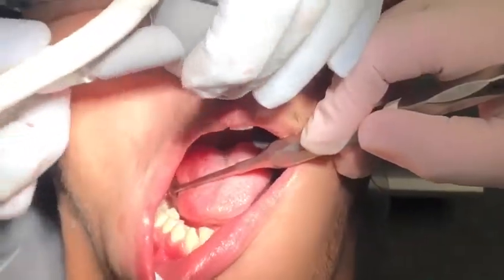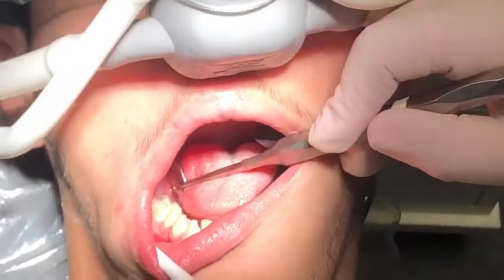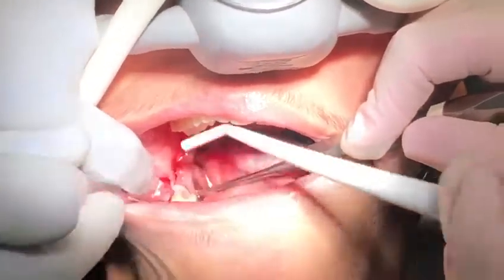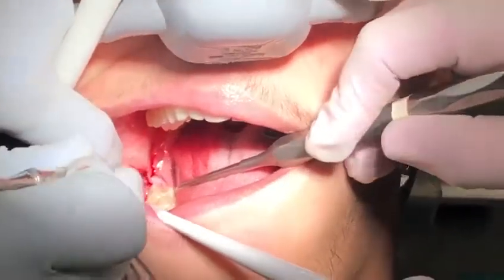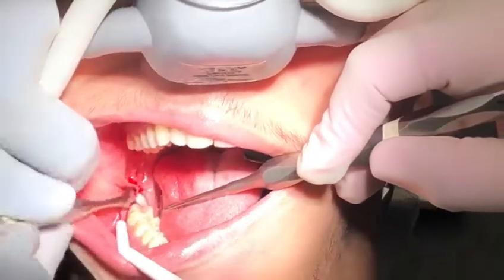Any problem? Let me adjust this a little bit for you. Great. You're going to feel a touch of pressure — pushing, pushing, pushing. Very good. And here as well, pressure.